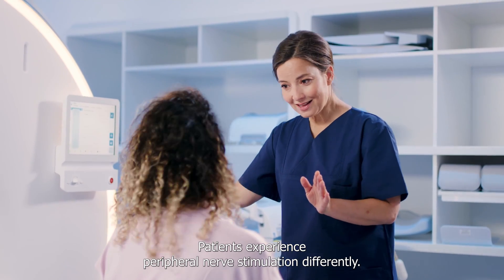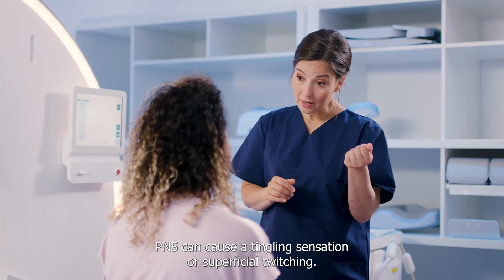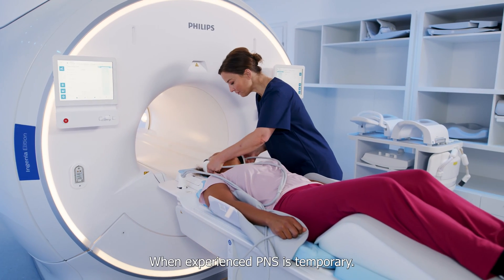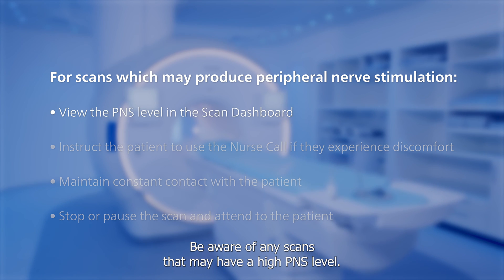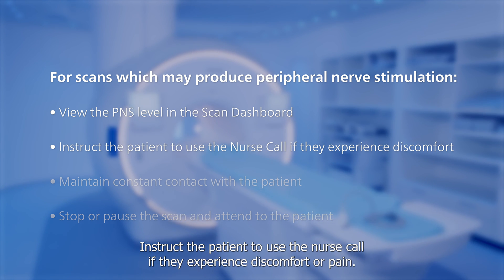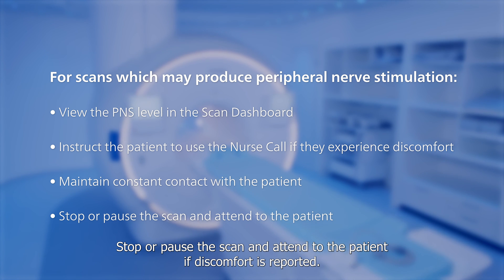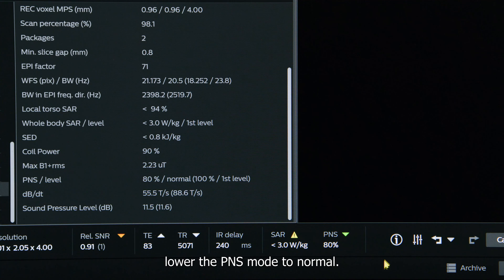Patients experience peripheral nerve stimulation differently; the location where it is felt and the physical effects will vary. PNS can cause a tingling sensation or superficial twitching, and some patients may report these sensations as painful, though it is often experienced as discomfort. PNS is temporary. For scans that may produce peripheral nerve stimulation, be aware of any scans with a high PNS level — this can be viewed in the scan dashboard. Instruct the patient to use the nurse call if they experience discomfort or pain, and maintain constant contact with the patient during the examination. Stop or pause the scan and attend to the patient if discomfort is reported. If signs of PNS are reported, such as tingling or superficial twitching, lower the PNS mode to normal.